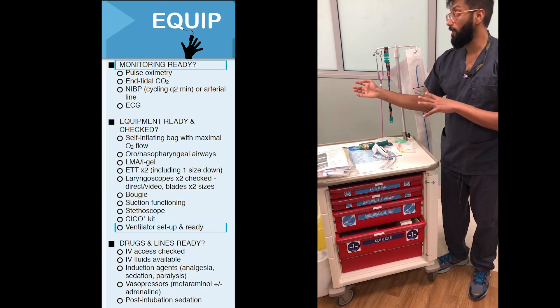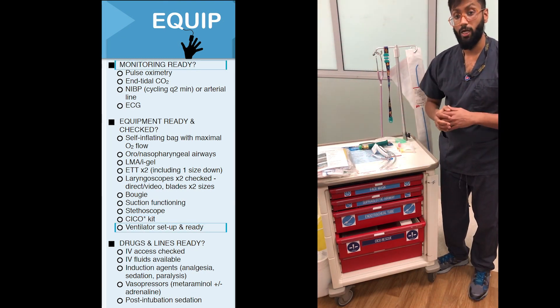The final things you require are your ventilator set up and your monitoring all set up, and we'll look at the bed space.